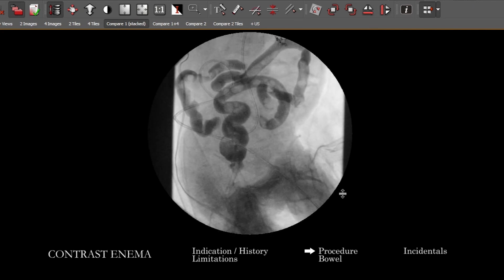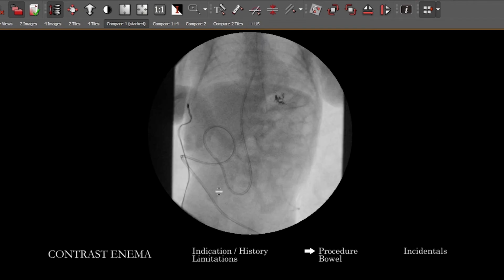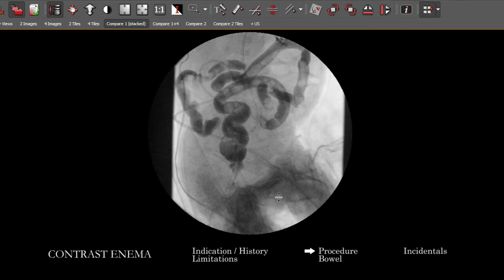Perfect, right? So this will be the last image we have here, and it will be the same or very similar to the last saved summative images that we showed at the beginning of the study. So let's go all the way to the end again.